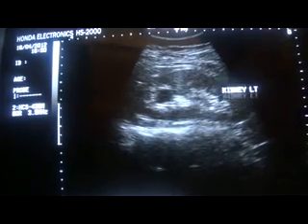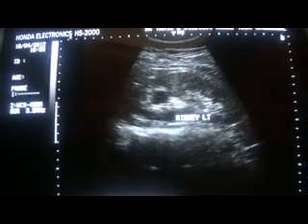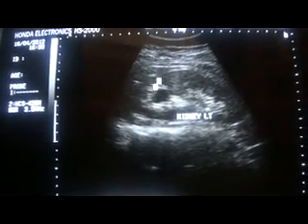This is the cortex and this is the medulla central sinus echo complex. So this is a medullary cyst. These are common incidental findings of no significant clinical importance; however, they should not be confused with the dilated calyx or some other pathology.